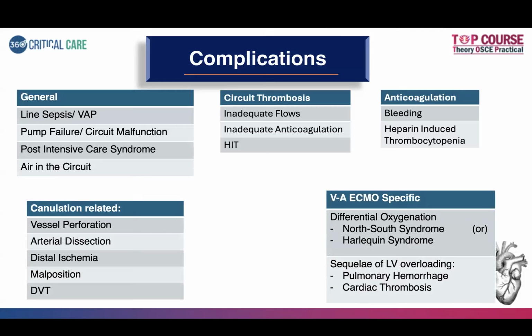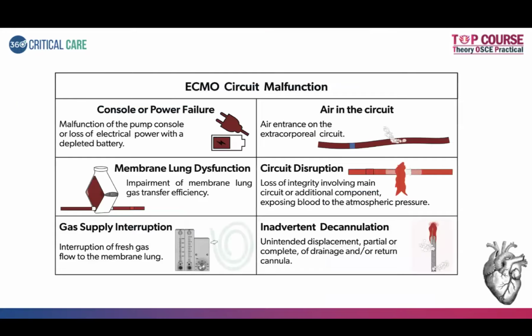So, general circuit thrombosis, anticoagulation, cannulation related, and VA ECMO specific. In this, the most important thing that you need to keep in mind before the exam is North-South syndrome. Before we go on to that, I'll just give you a cover of ECMO circuit malfunction. What are the possible problems that can occur?